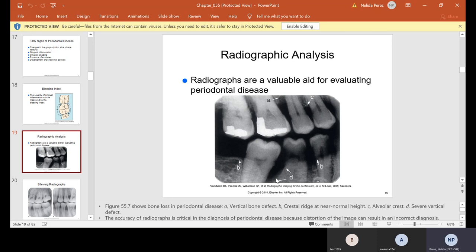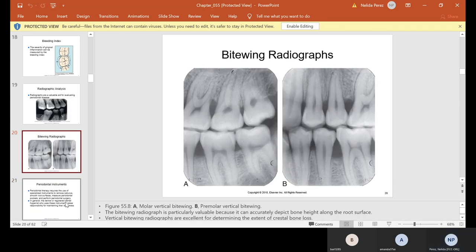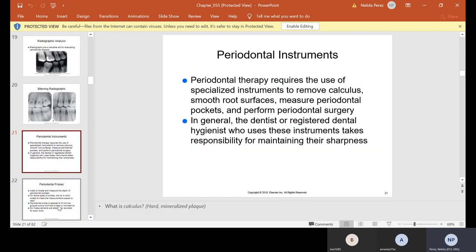A lot of periodontists like vertical x-rays instead of horizontal ones, because they show more of the crestal bone loss, so they can see better how much bone has been lost. The bone should be at the top on this molar, but over here it starts dipping — the interproximal area especially, which has a lot to do with lack of flossing and lack of coming in to have your teeth cleaned, leading to calculus buildup.